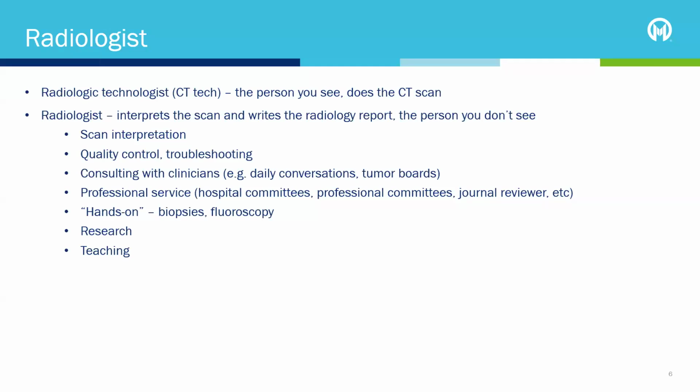I'm the radiologist, so I'm the person that you don't see involved with that process. So once those images are acquired, they're digitized and put on a computer network. And so it's not uncommon now that the physical location you get the scan, the radiologist who looks at that scan and creates the radiology report may not even be in the same building.